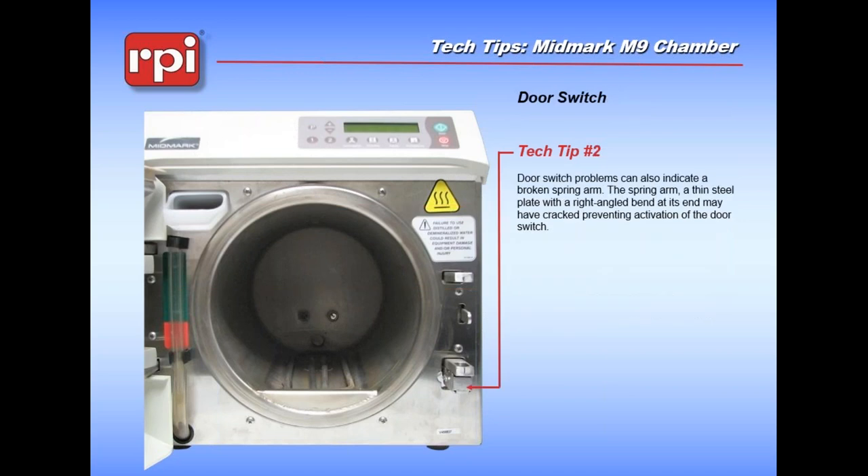Check number two for the door - the door switch. This is what determines whether your door is open or closed - that's how the machine knows. Those door switches are constantly getting exposed to steam. They do fail over time. Also, within this little bracket there is a plate of spring steel that actually activates the switch - it's got a little bend on the end of it. If your door switch will not work properly, first thing would be to replace it. But if that still doesn't solve it, that little bracket may have snapped and you can't actually activate the button on the top of the door switch. You want to keep an eye out for that one.